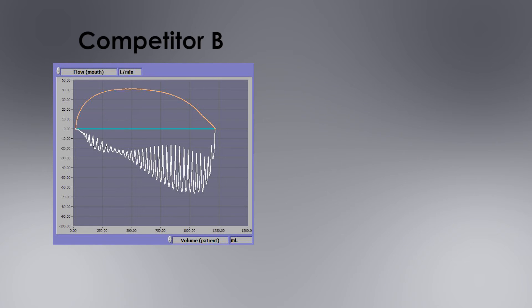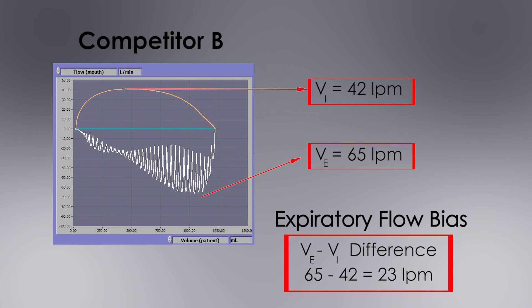Now looking at the flow loops generated by the other OPEP device, competitor B, the peak expiratory flow is 65 liters per minute. The peak inspiratory flow is 42 liters per minute. So the difference is 23 liters per minute.